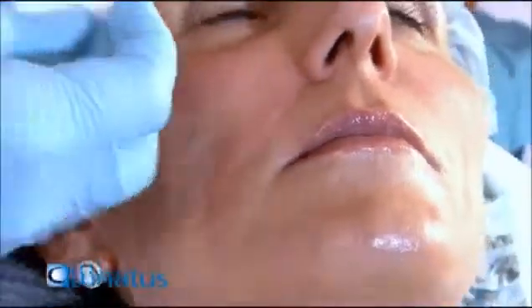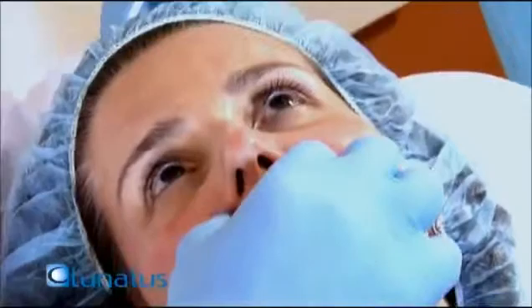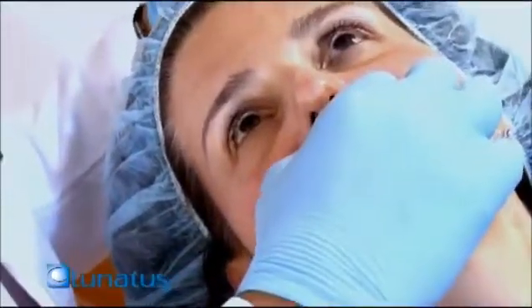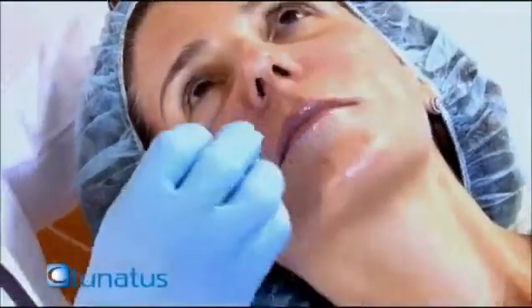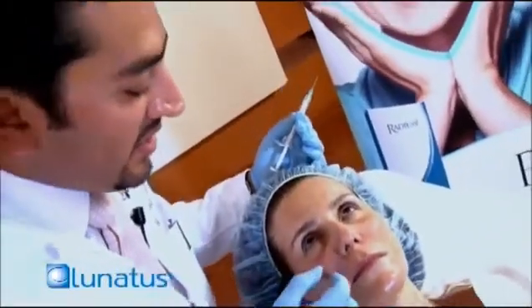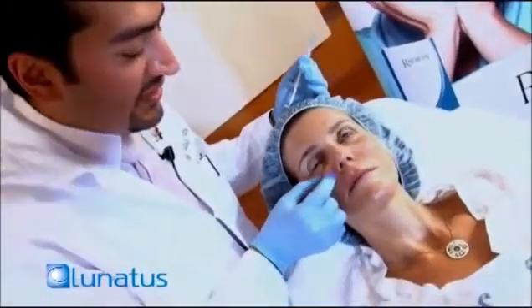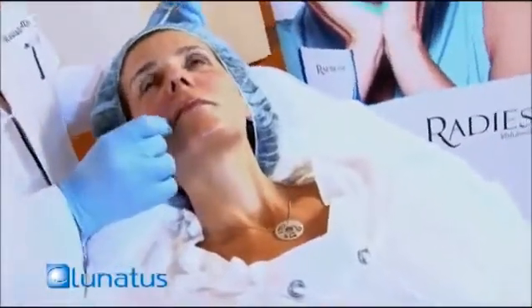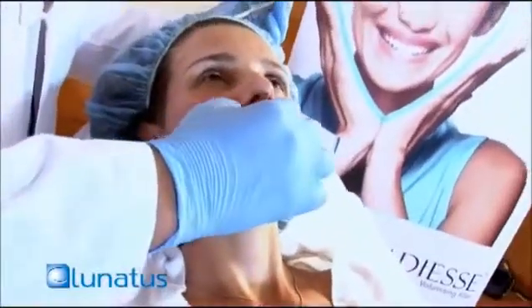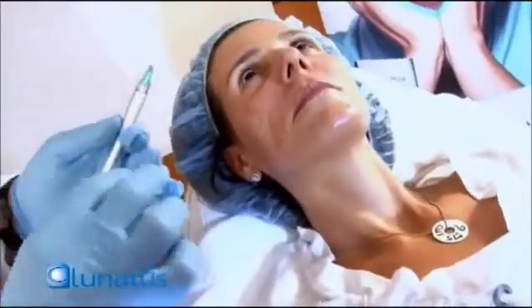Massaging is also very very important here. We're using a very small amount — about 0.2ml right here — and that's all she's going to need, because we've injected the cheeks first: the mid-cheeks and also the cheeks themselves. She requires a very small amount to be injected in the nasolabial folds.